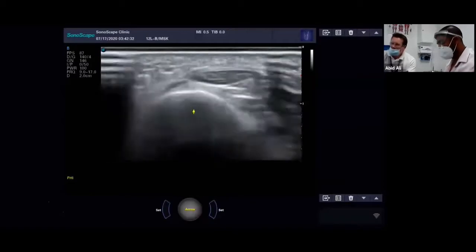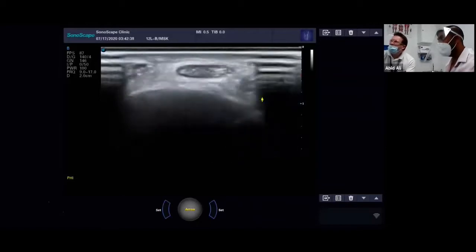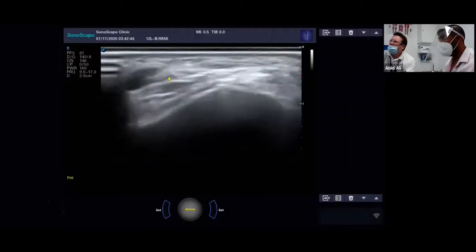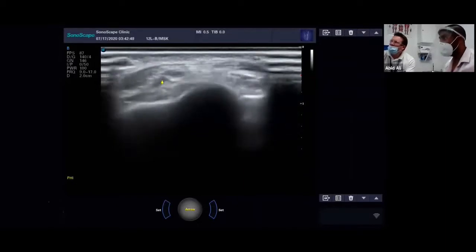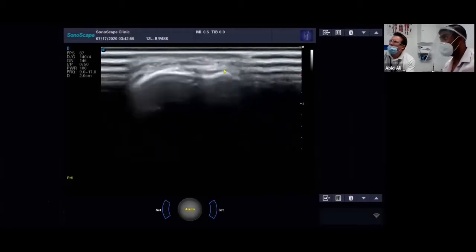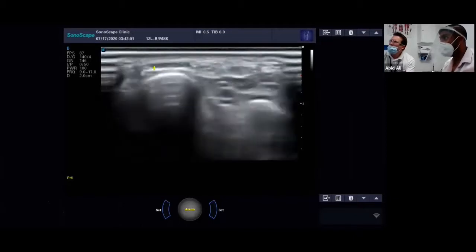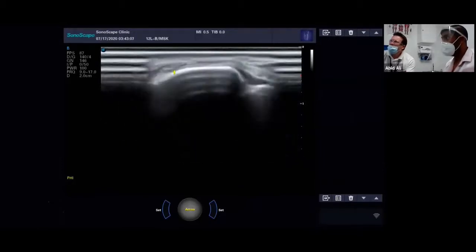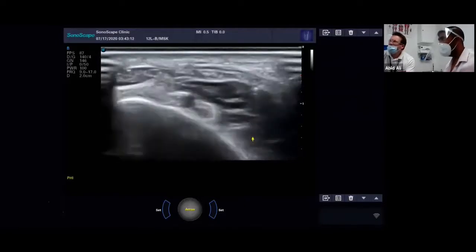So as you can see, I'm just constantly manipulating the probe medial to lateral, keeping the extensor hallucis in the middle. I'm just going to follow that all the way down again. I'm just going to speed it up because I've covered it a little bit before. And there you can see we're starting to lose it a bit, so we'll just ask Adrian to wiggle his toe. And we can make it out again. There we go. It's flattening and broadening out. We'll just go to the MTP joint, keep it in the middle here. And that's your extensor hallucis. Okay, so I think we've covered all the anterior ankle tendons there.